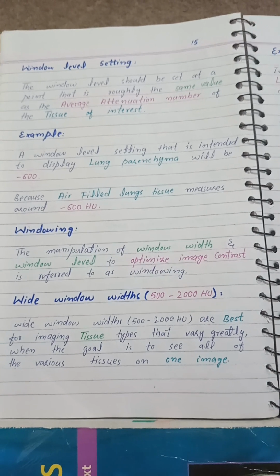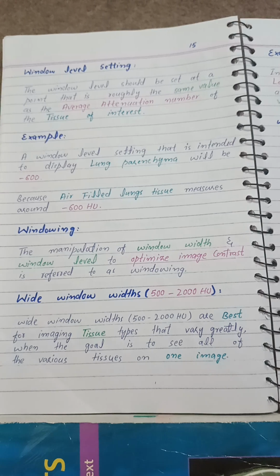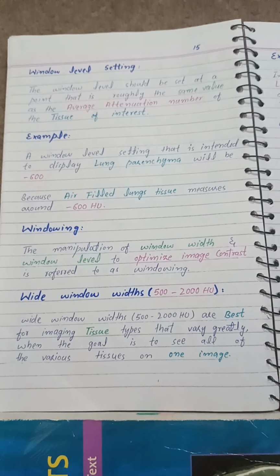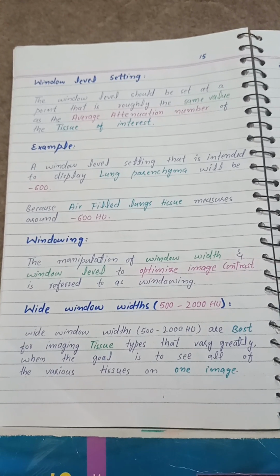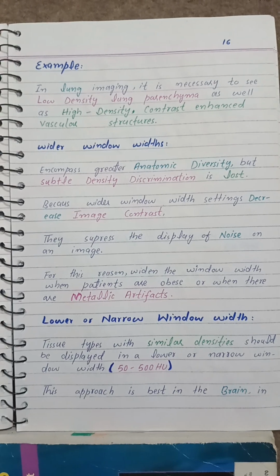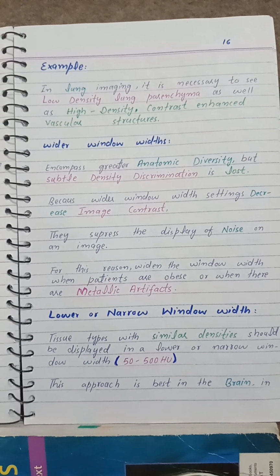Window width 500 to 2000 Hounsfield units. Wide window widths are best for imaging tissue types that vary greatly, when the goal is to see all of the various tissue on one image. For example, in lung imaging, it is necessary to see low density lung parenchyma as well as high density contrast enhanced vascular structures.